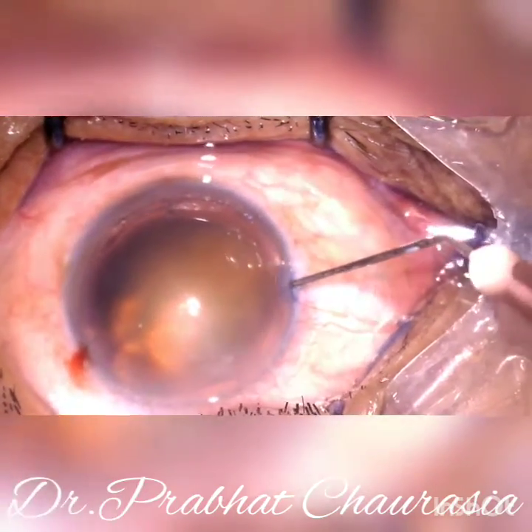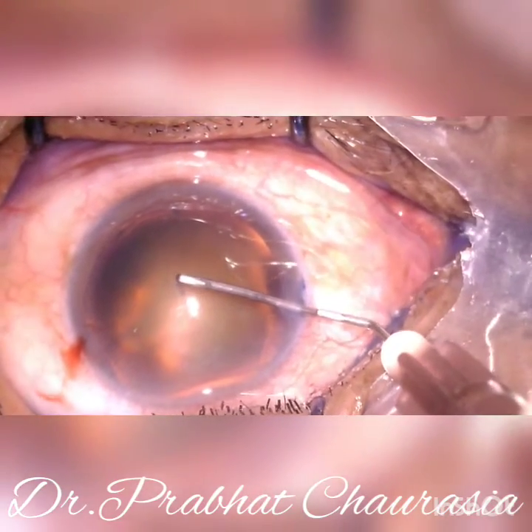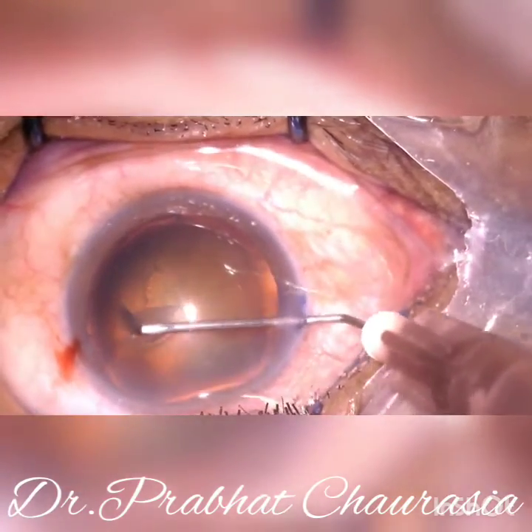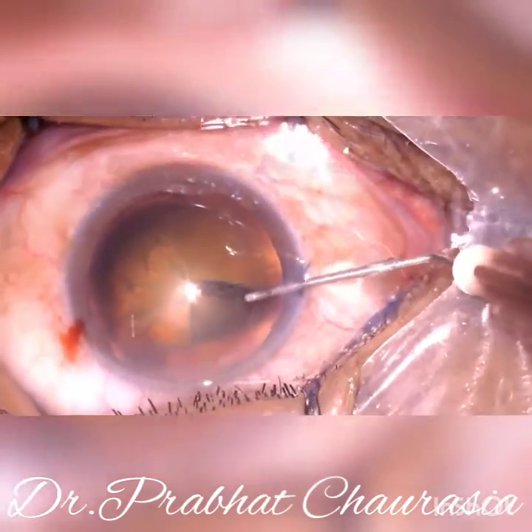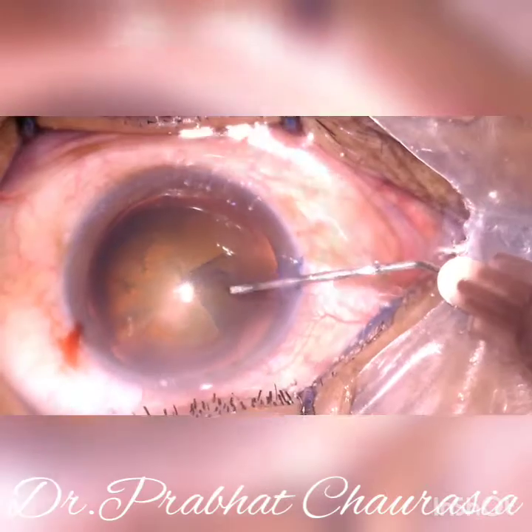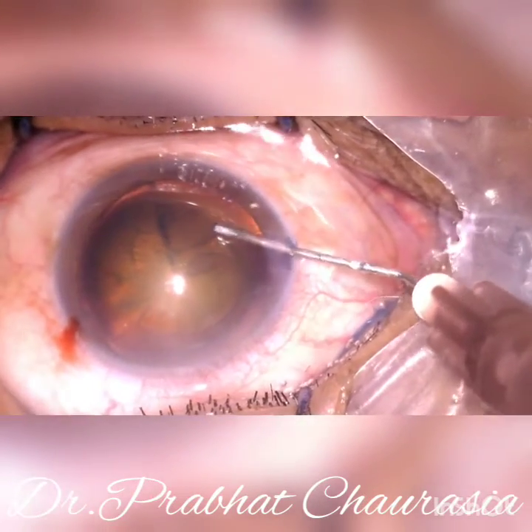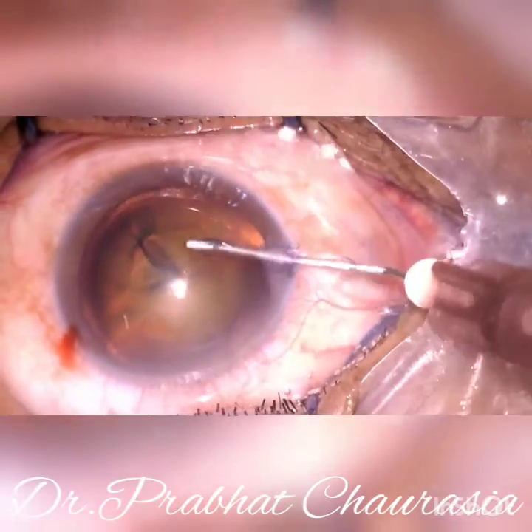Make the rhexis of a good size, about five to six millimeters. While making the rhexis, keep in mind that the IOL margins should be covered by the rhexis margin. In soft cataracts you can make a smaller rhexis, while in hard cataracts you need to make a larger rhexis.